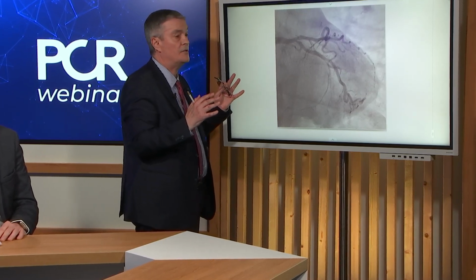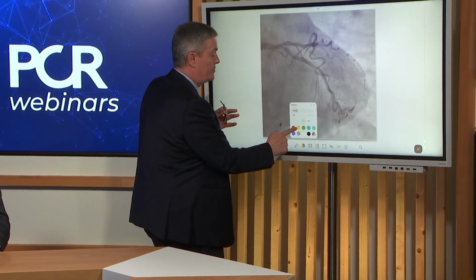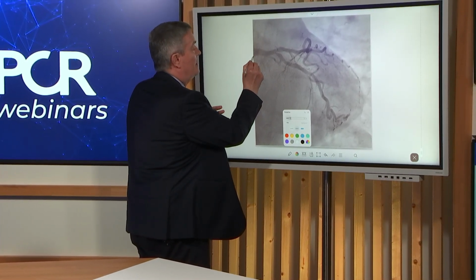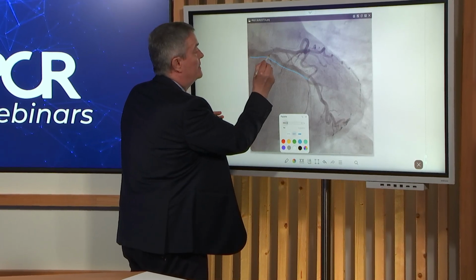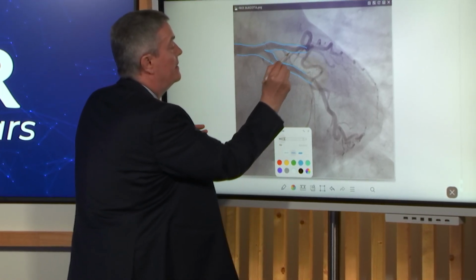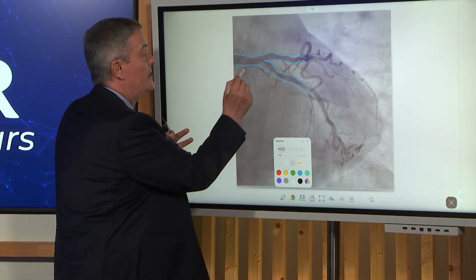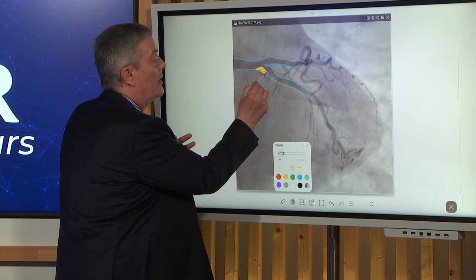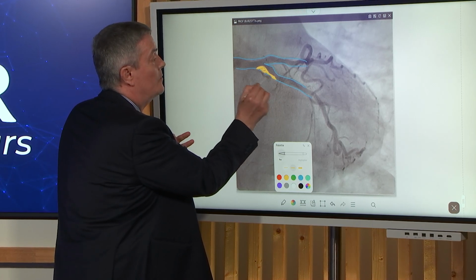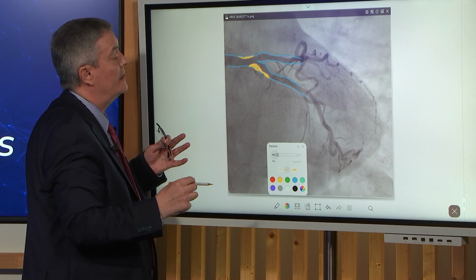In case of impossibility to use imaging, I try to anticipate plaque distribution based on angiography. So, for example, if we look at this lesion here, I draw the vessel contour first. So this is the vessel contour, and then this is the left main, LAD. This is the LAD. And then I know that plaque is usually located in the lateral wall of the bifurcation, opposite from the carina. So in my view, this is plaque at the ostium of the circ. And also there is some mild atherosclerotic burden in the left main.